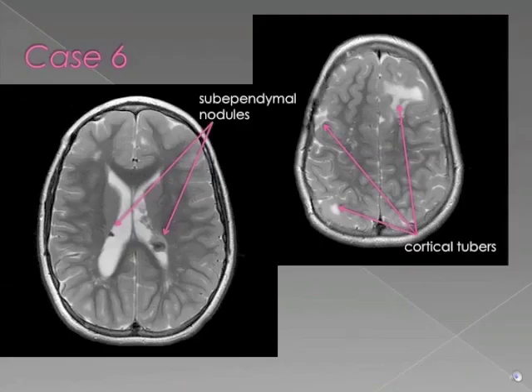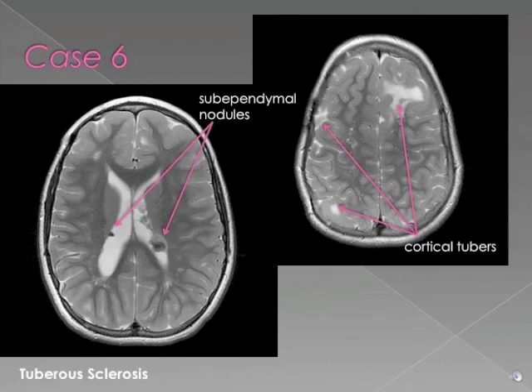In Case 6, we have two axial T2-weighted MR images. The first demonstrates bilateral subependymal nodules. The central T2 hypointensity within these nodules is consistent with calcifications. The second image demonstrates cortical and subcortical T2 hyperintensity in the bilateral cerebral hemispheres. This is a classic case of tuberous sclerosis.